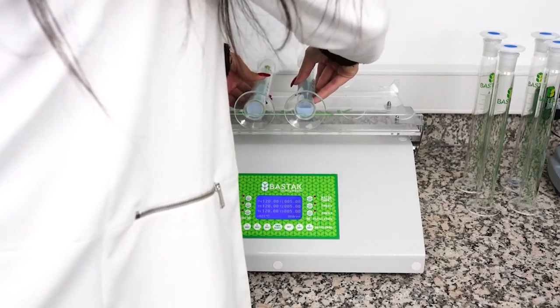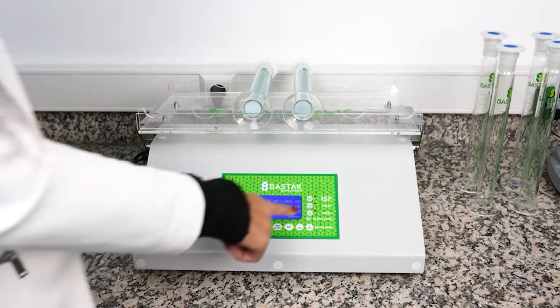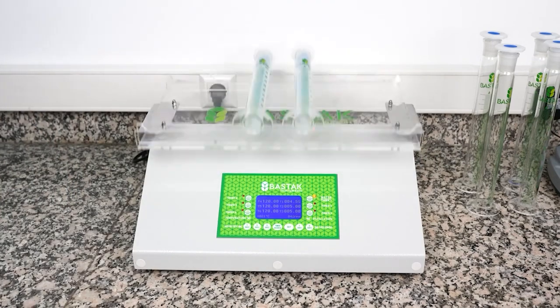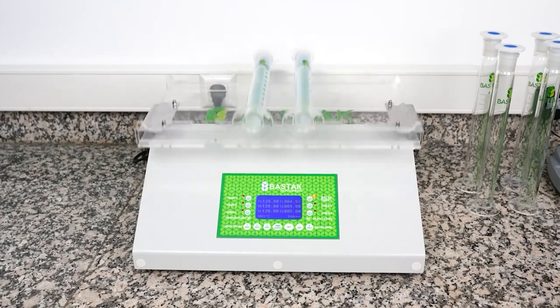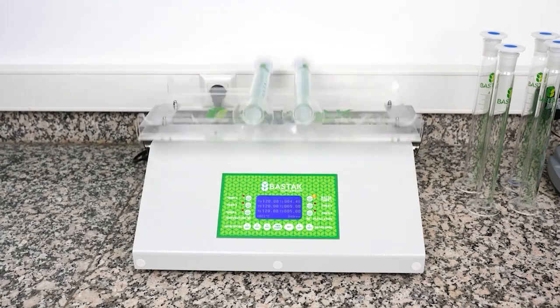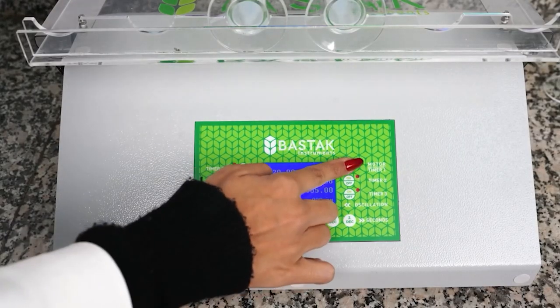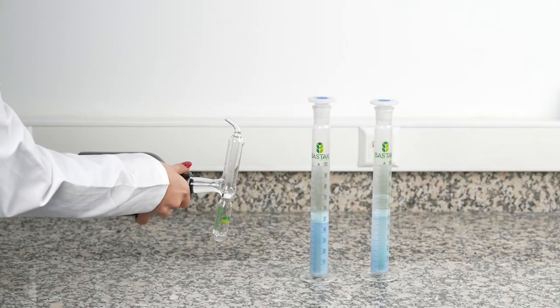After the shaking process is completed, the tubes are placed on the sediment table, and the Motor Plus Timer 1 button is pressed. The device initiates a 5-minute shaking process, with shaking at a 30-degree angle at 40 revolutions per minute, visible and controllable from the LCD screen on the device. When the 5-minute shaking process is complete, the device provides an audible warning. Press the Motor Timer Ready button, and the tubes are carefully taken and placed on the table.